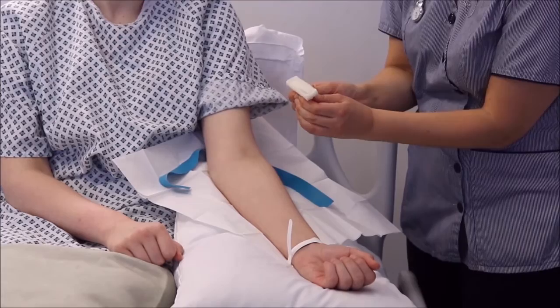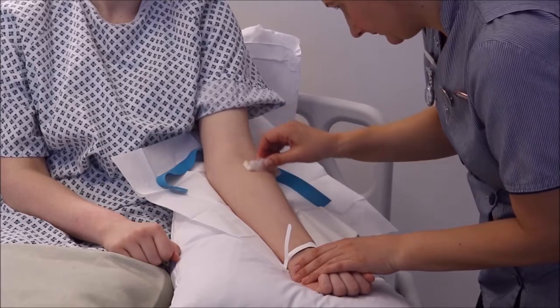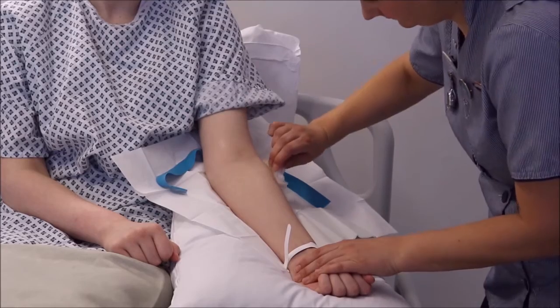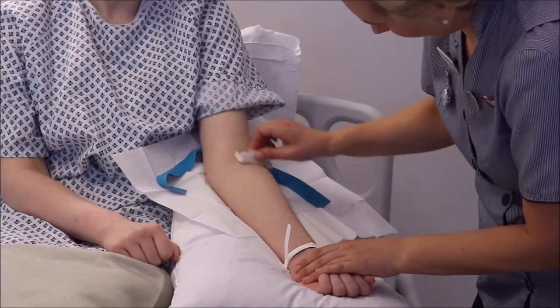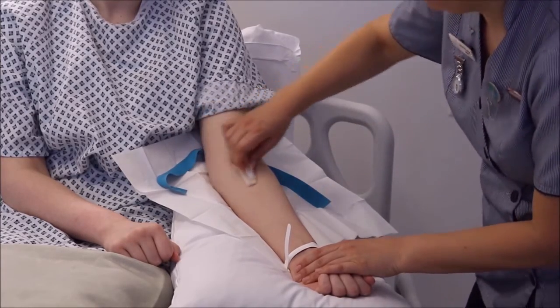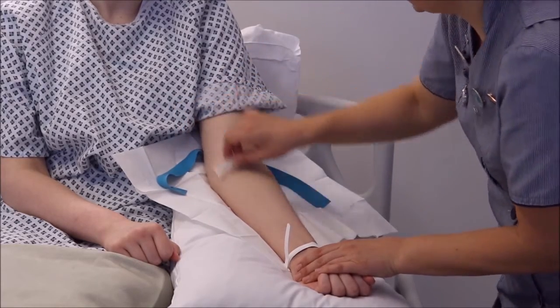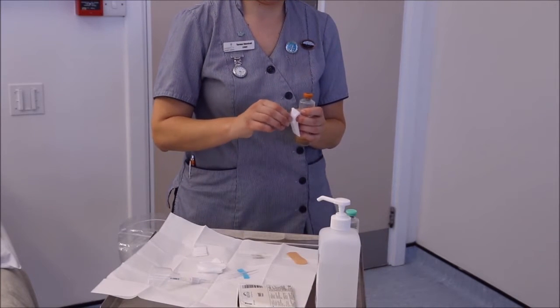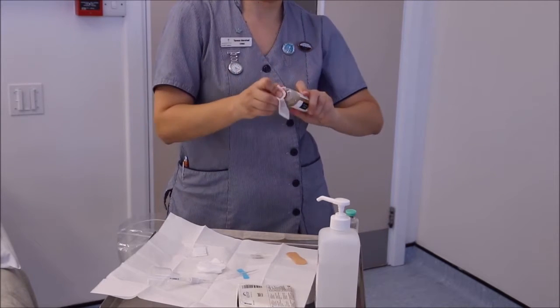Decontaminate hands. Open the chlorhexidine alcohol applicator by squeezing the handle to click and activate. Wipe north-south and east-west for 30 seconds. Do not wipe in a circular motion. Allow to dry for up to 60 seconds. Remove the plastic caps from the bottles. Effectively clean each one with a separate chlorhexidine alcohol wipe for 15 seconds and allow to dry.